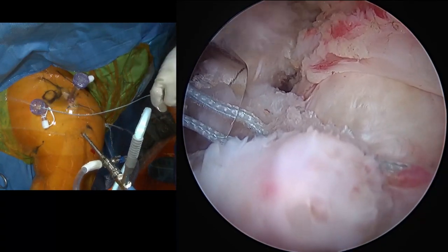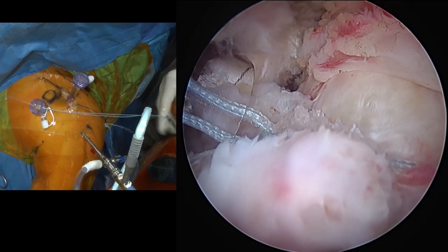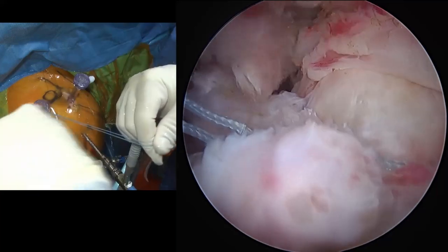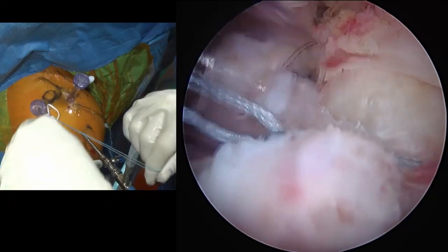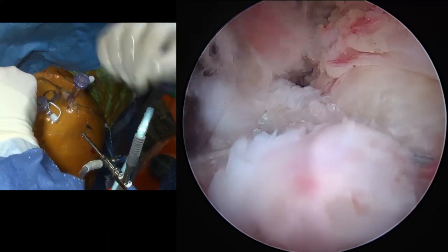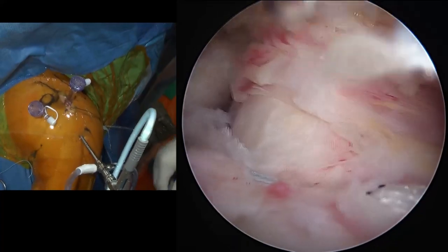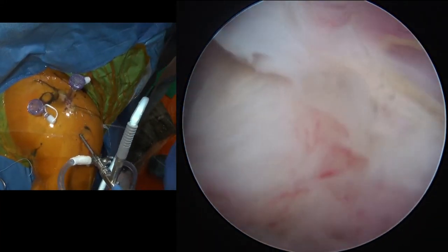Okay, so this gives us sort of a provisional anterior placement of our cuff, which is close to where we want it to be, and now we've got to do our double row laterally over the footprint to secure that down. Let's have a shaver just to kind of clean up our space a little bit. Let's hand it this way. Thank you.